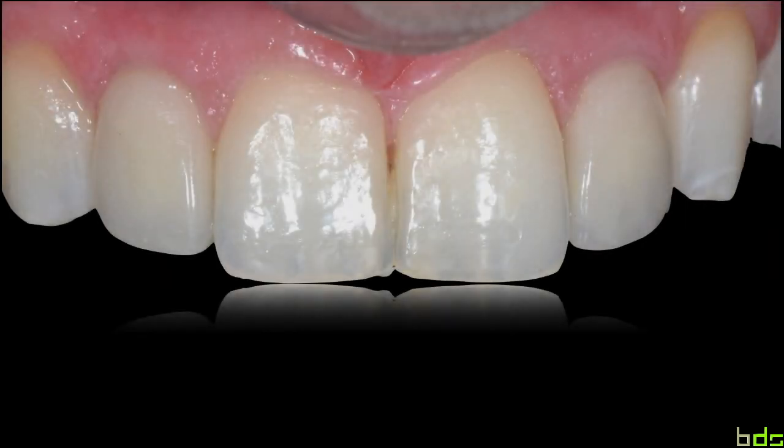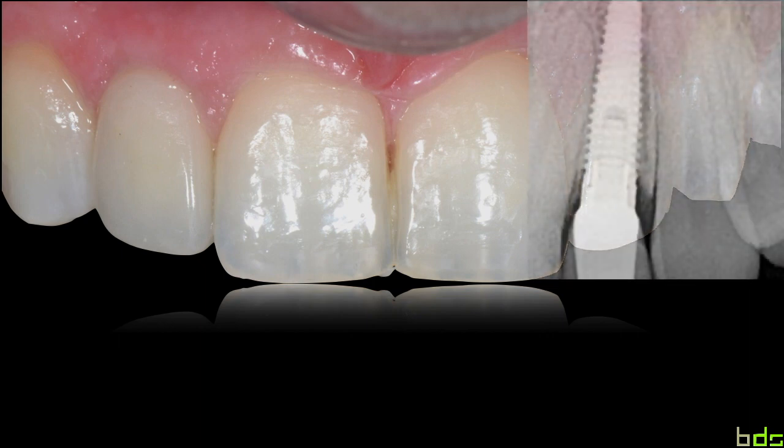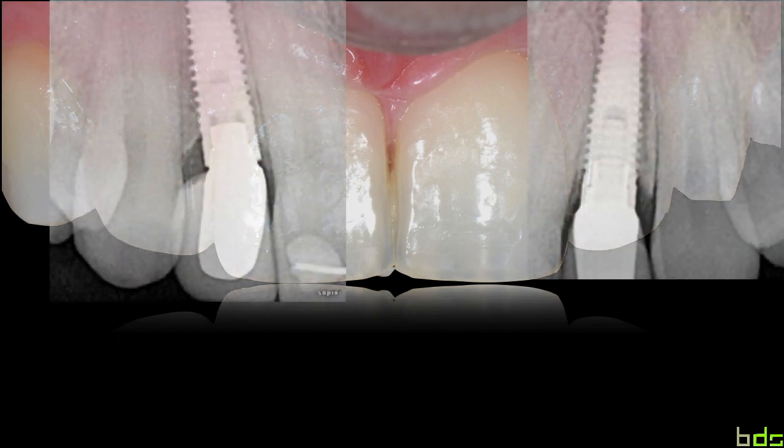Here in that case, where we replaced 2 missing laterals with dental implants, and the 2 implants had 2 distinct macrogeometries. The one on the right side of the patient is a Nobel conical implant, and the one on the left is a Nobel Select trilobe connection. 2 different connections, 2 different peri-implant macrogeometries, same brand.